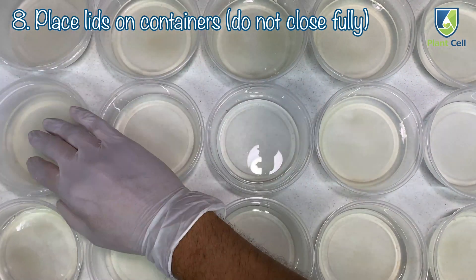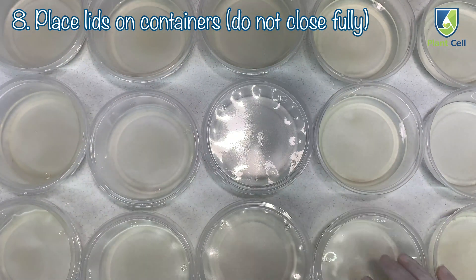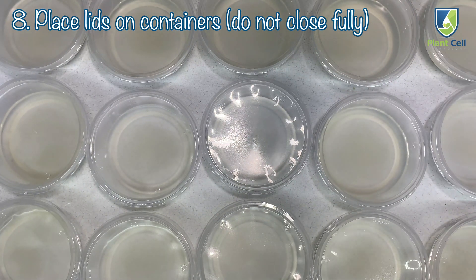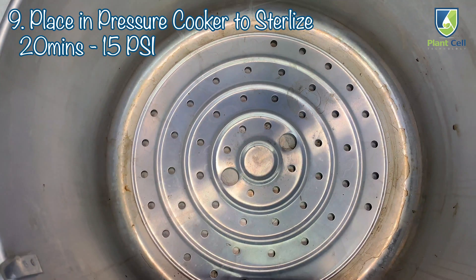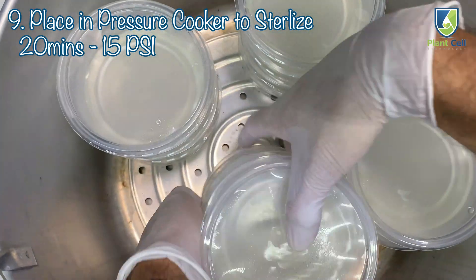Place lids loosely on top of all containers. Place all containers in pressure cooker for sterilization for 20 minutes at 15 psi.